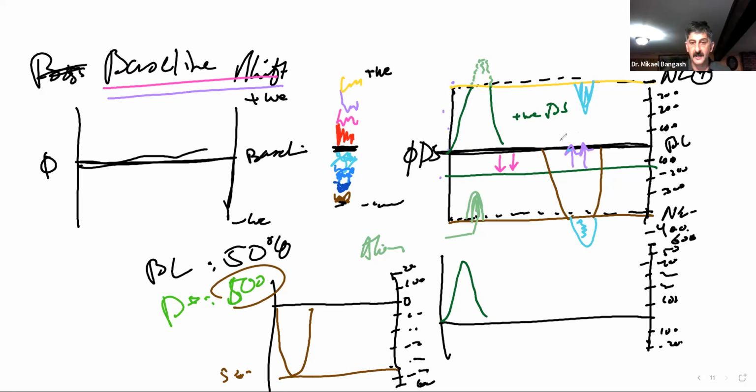Likewise, we can raise the baseline up, because we had a negative Doppler shift which was giving us a problem because it was at a speed greater than our negative Doppler shift limit. By raising the baseline, which is again just shifting the baseline, the velocities that we were able to measure on the negative side increased until we didn't have any aliasing anymore.